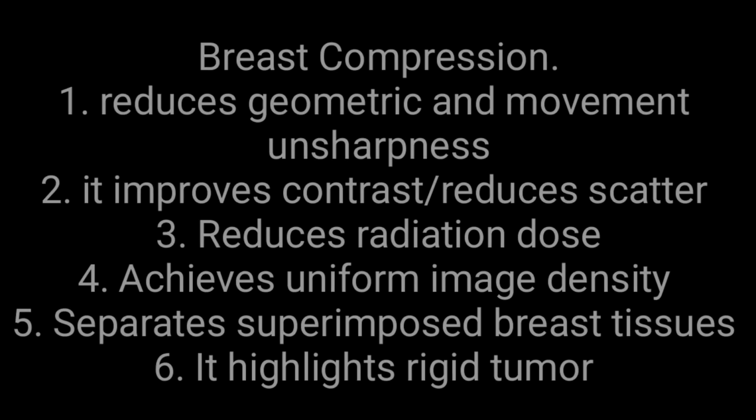So less tissue needs to be penetrated. Because of the compression, less tissue will be exposed to the radiation. As a result, the radiation dose will be reduced. It achieves uniform image density. By compression, you can appreciate a uniform density of the image, and it also separates superimposed breast tissues. If there is superimposed breast tissue, due to the compression, it will just slip to the sides, and the targeted lesion would be in a proper appearance, and it will achieve a uniform image density.